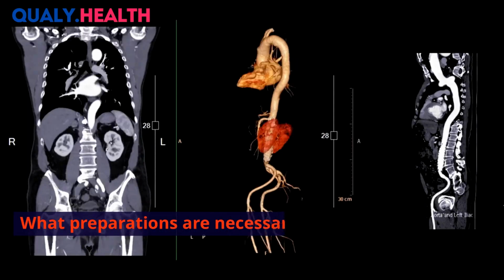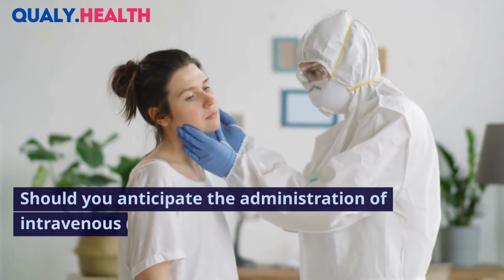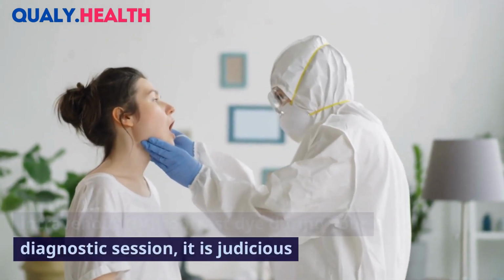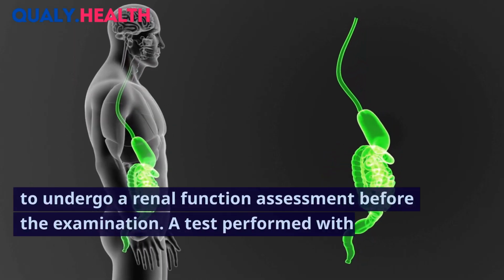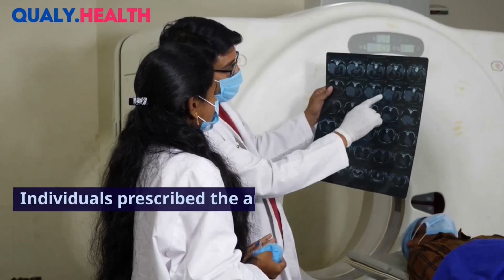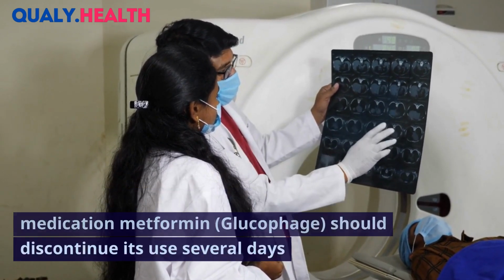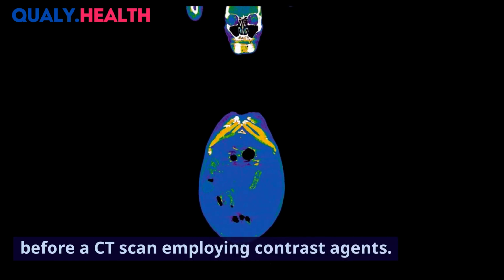What preparations are necessary for the procedure? Should you anticipate the administration of intravenous contrast dye during your diagnostic session, it is judicious to undergo a renal function assessment before the examination. A test performed within the preceding 6 months may suffice in this regard. Individuals prescribed the antidiabetic medication metformin, Glucophage, should discontinue its use several days before a CT scan employing contrast agents.